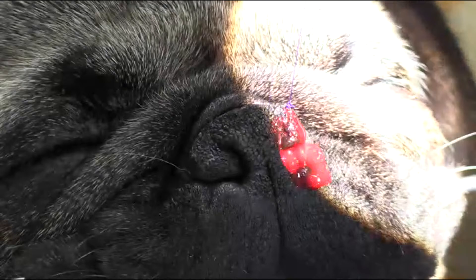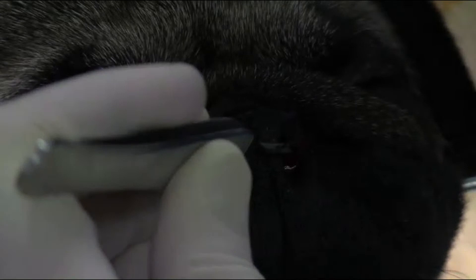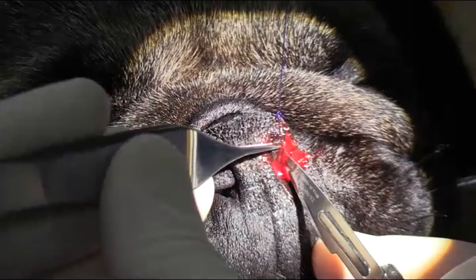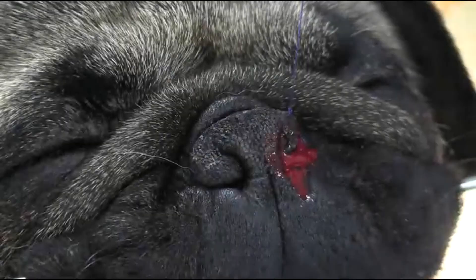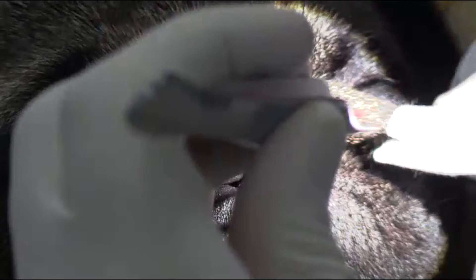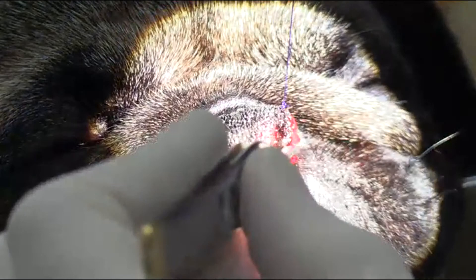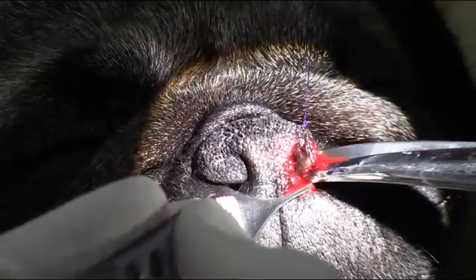Just having a look at what we've removed — I can probably take out a little bit more. Just making sure that we're taking out an adequate amount. My thumb forceps weren't really gripping the tissue and so I wasn't able to remove as much as I wanted.